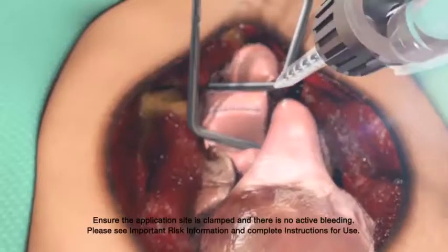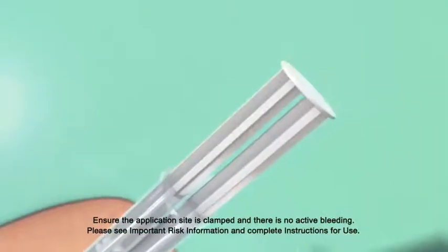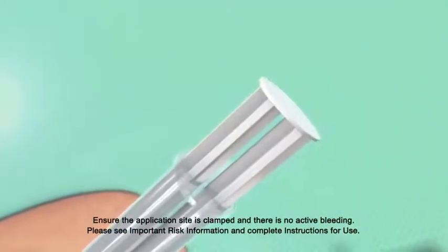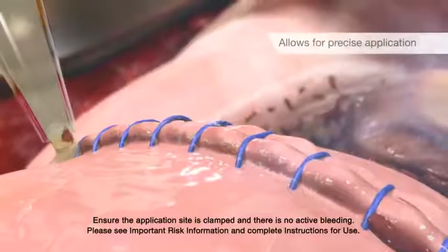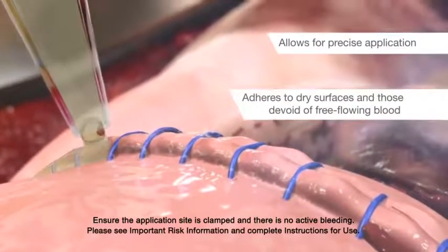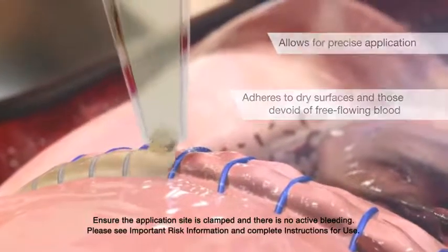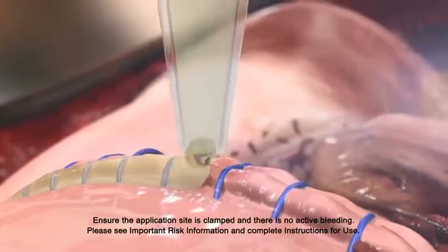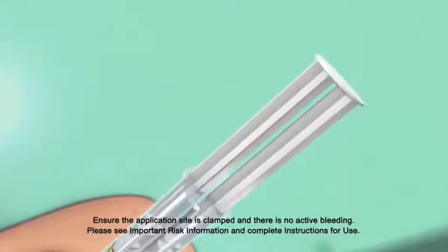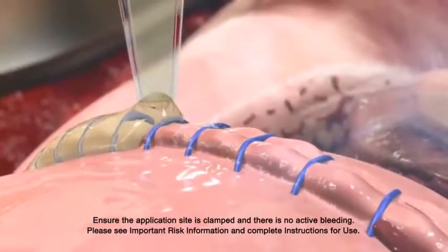Previleak is designed for simple and precise application. The pressure applied to the plunger affects the viscosity of the sealant, allowing for precise application and adhering to dry surfaces and those devoid of free-flowing blood. With quick plunger depression, Previleak will initially apply in a thin, less viscous layer. With slow depression of the plunger, it will initially apply in a thicker, more viscous layer.